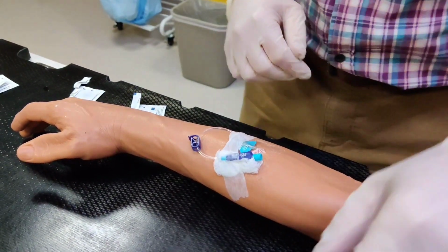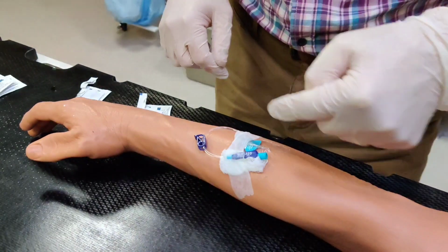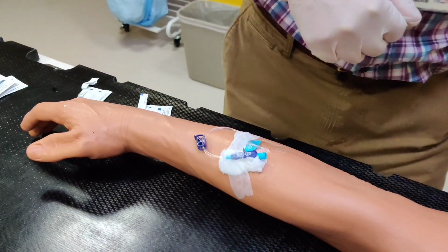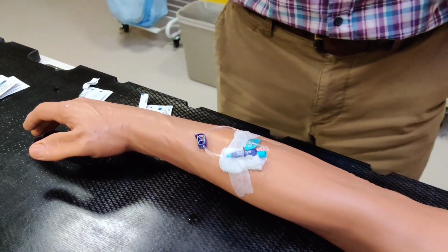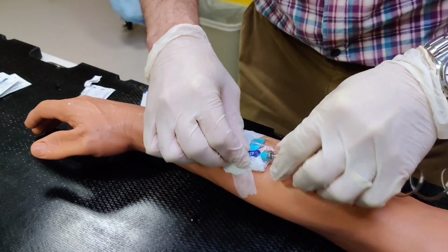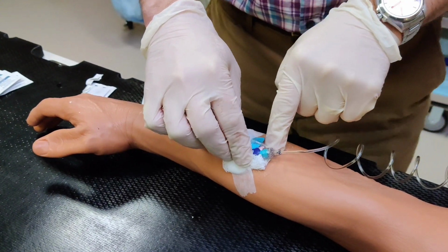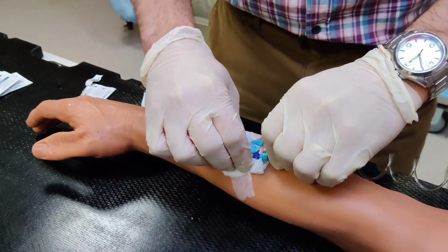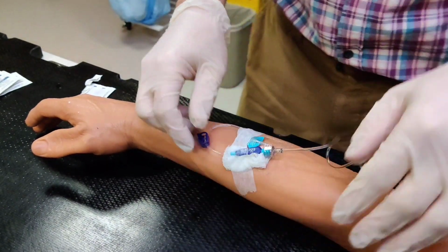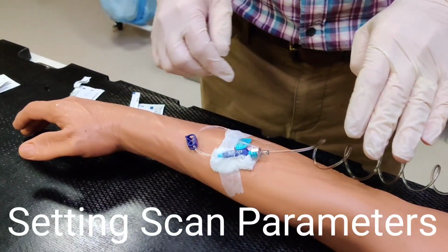And at this point, depending upon the procedure, if I need to recap, I can sterilize the line again and put the cap back on, or I can go immediately to the IV line and tighten that on. And again, if in doubt, always wipe the IV port if you're concerned you've contaminated it. In this case, I've been very careful. Next thing I'm now going to do is open the clamp, and now we have the intact system ready to go for the contrast injection.